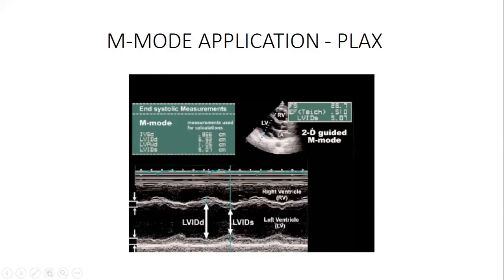So when there's thickening of this septum, which is one of the walls of the heart, or thickening of the posterior wall, we call it hypertrophy. There are a lot of causes, but the major one is uncontrolled chronic hypertension, or in sports professionals, athletics.